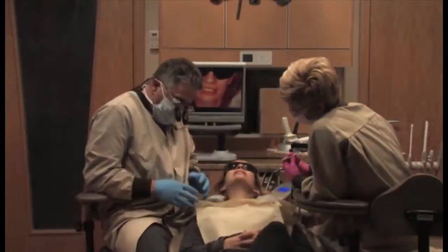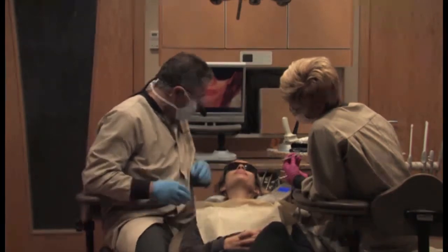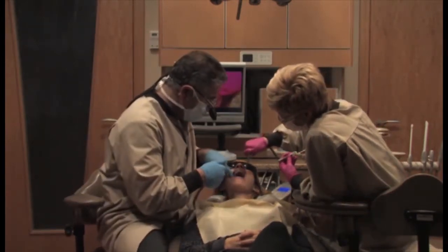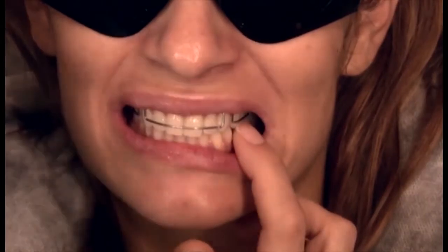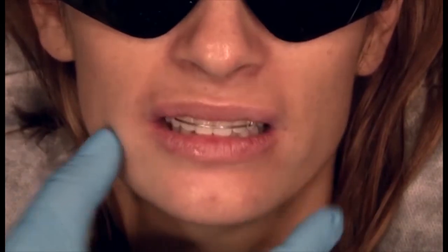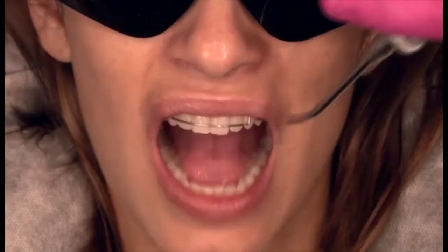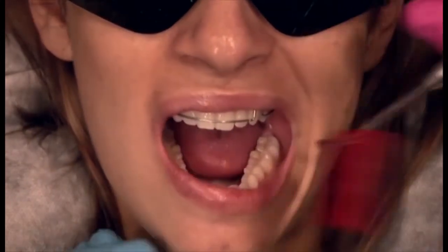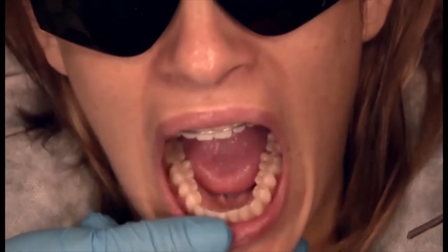Now, as we put it back in, do you feel any contact in the back? Yes. Where? Right and left. You're starting to feel the left side. On the left side, where do you feel the contact? Back there. When you feel the contact now, is one side stronger than the other side? Perhaps this side is a little bit stronger. Let me check with, we'll mark it, tap up and down, open. You do have quite a few red marks on that side.